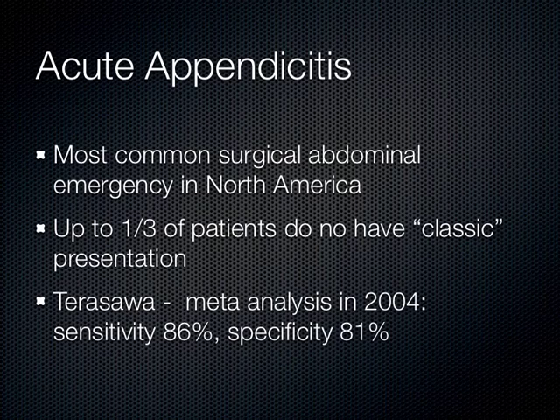Now, going forward in the future, I think ultrasound in the hands of the clinician, the person that's actually evaluating the patient at the bedside and knows exactly where the patient's got the pain, and sometimes I even hand the probe to the patient. I go, okay, put this where the pain is. And the patient sticks it right there, and then I push down there, and then, oh, hey, there's the appendix. The patient found it for me. I think once we see that data start to get out there, the test characteristics will improve. In fact, in other countries where ultrasound is much more accepted in the hands of the clinician, we see incredibly high rates of accuracy with ultrasound for appendicitis.